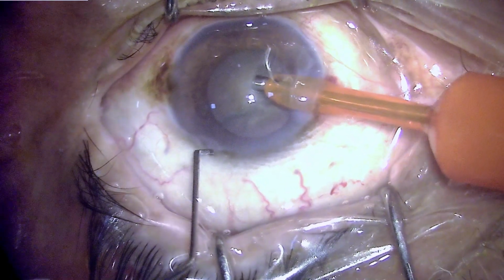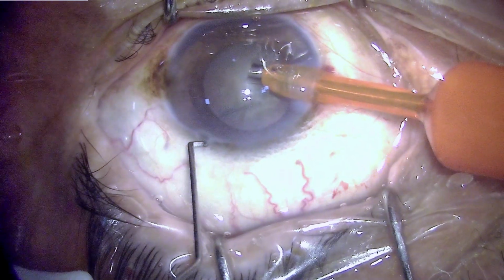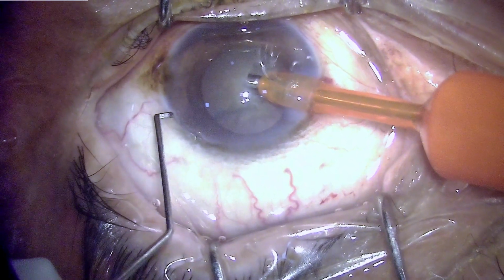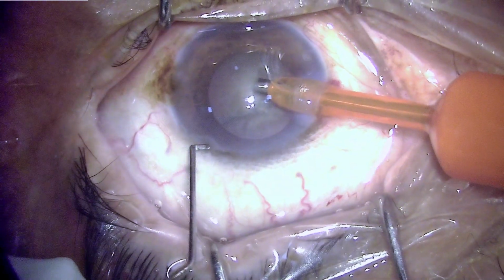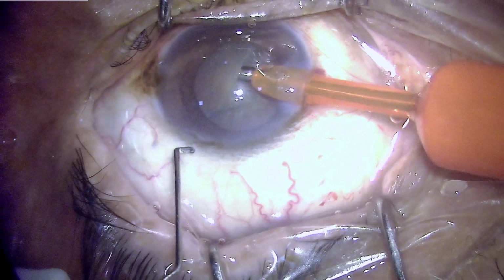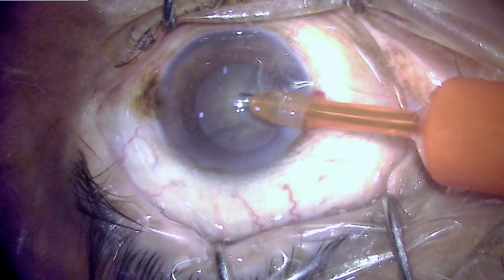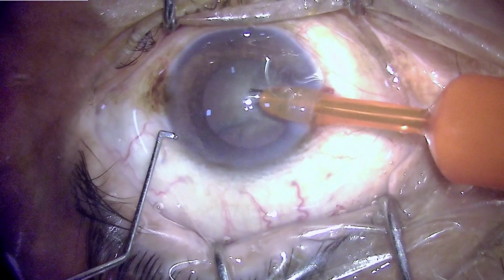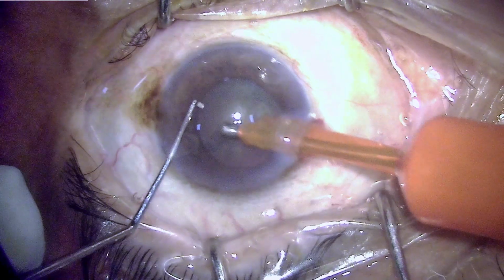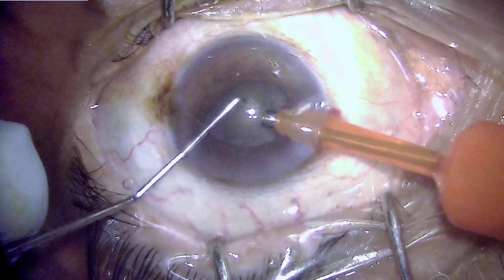And here is the interesting part where I seem to have missed the side port incision site because it was so nicely made that it is just impossible to find where it is. And more so, there was no oozing or the limbal blood vessels were not damaged, so it was very difficult for me to find out where the side port is. I was at the moment not sure whether I had made it, but finally I could trace the outline and we have started the phacoemulsification.